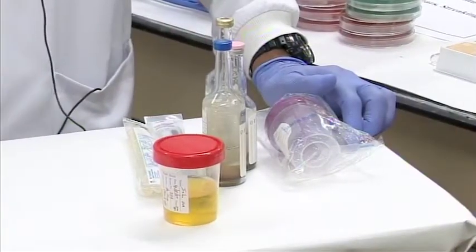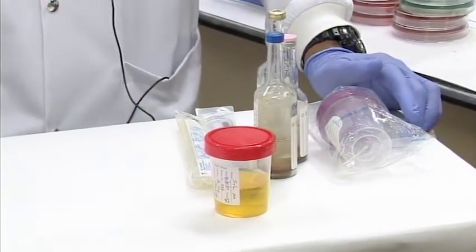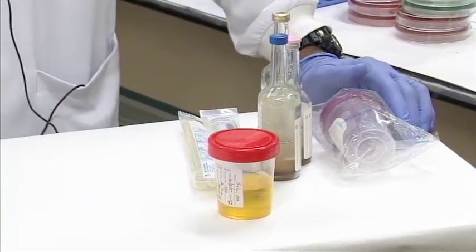It is very important for microbiological samples that specimens are collected at the appropriate time, ideally before the administration of antibiotics. The amount of specimen and the type of specimen will all influence the quality of the results. Now, we're going to get into the different types of specimens you may encounter in the microbiology lab.